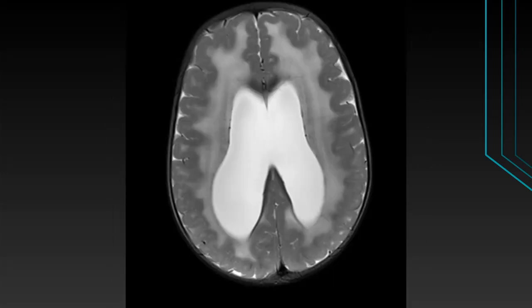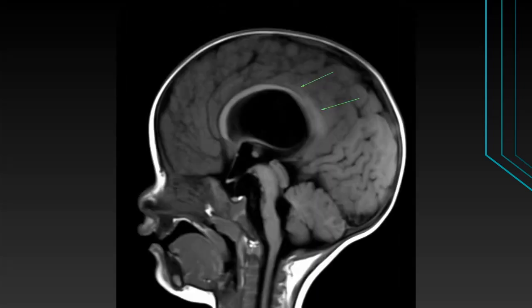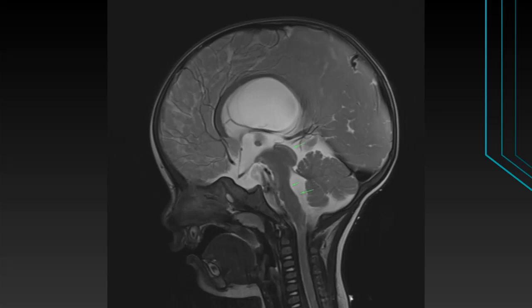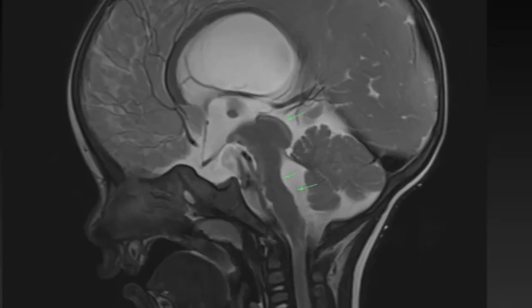The MRI shows thickened bumpy dysplastic gyri with shallow sulci in bilateral cerebral hemispheres, predominantly involving bilateral frontoparietal and temporal lobes. Gross ventriculomegaly is seen with splaying of the corpus callosum. There is possible hypoplasia or dysplasia of the posterior body and splenium of the corpus callosum. The tectal plate is enlarged, thickened, and malformed.